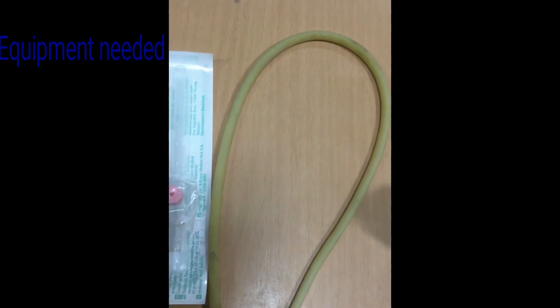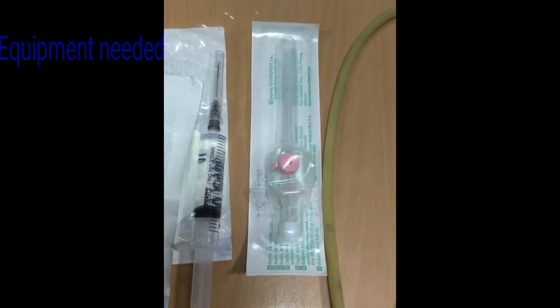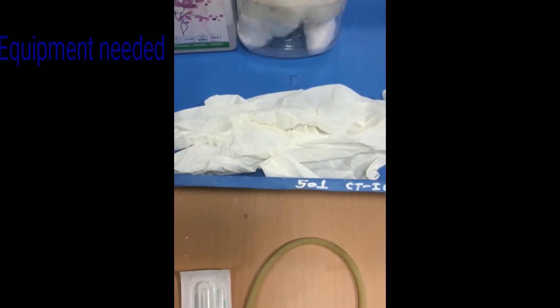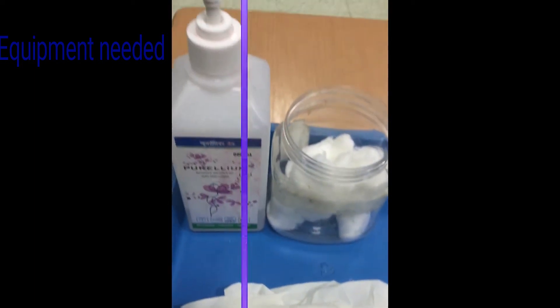Tourniquet, IV cannula of appropriate size, flush in 3-5 ml syringe, tape to fix the IV cannula, disposable clean gloves, cotton and spirit or alcohol.